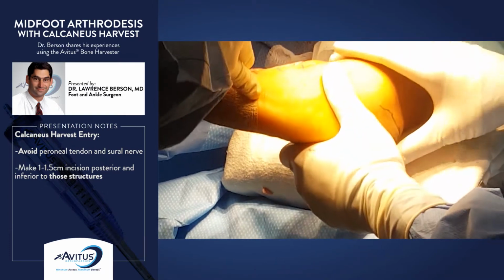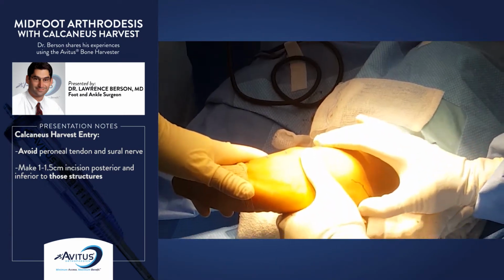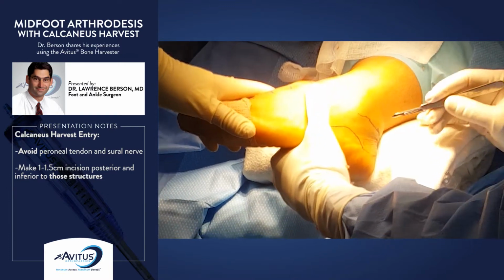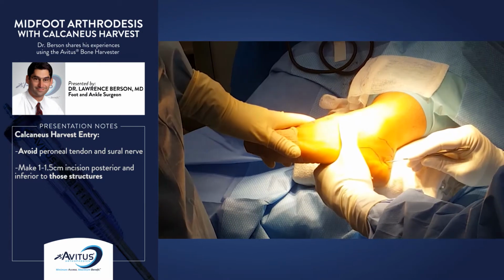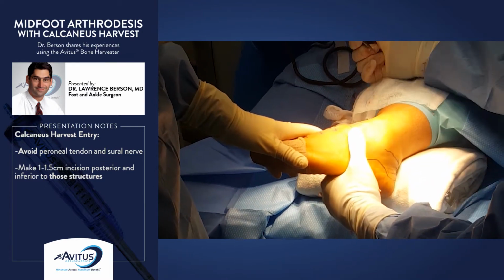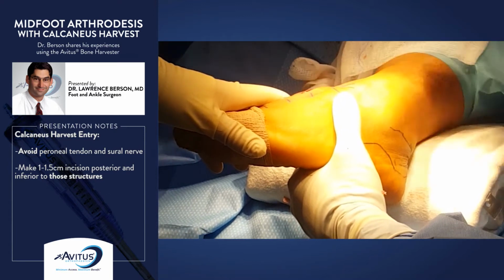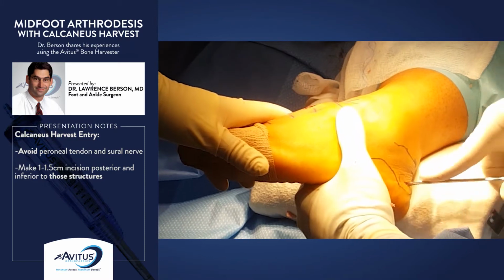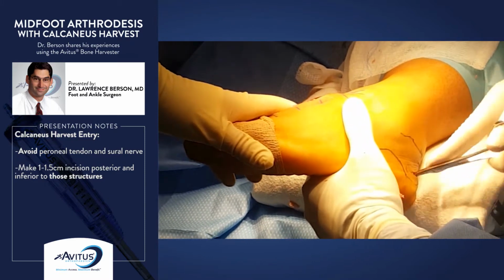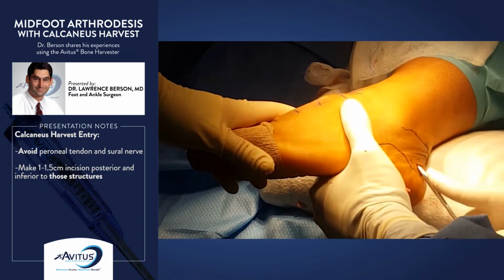The two structures you need to worry about, peroneal tendon, sural nerve, you just need to stay posterior, inferior to those. The starting hole is well placed, a good distance from those two structures. I made here about a 15 millimeter incision.